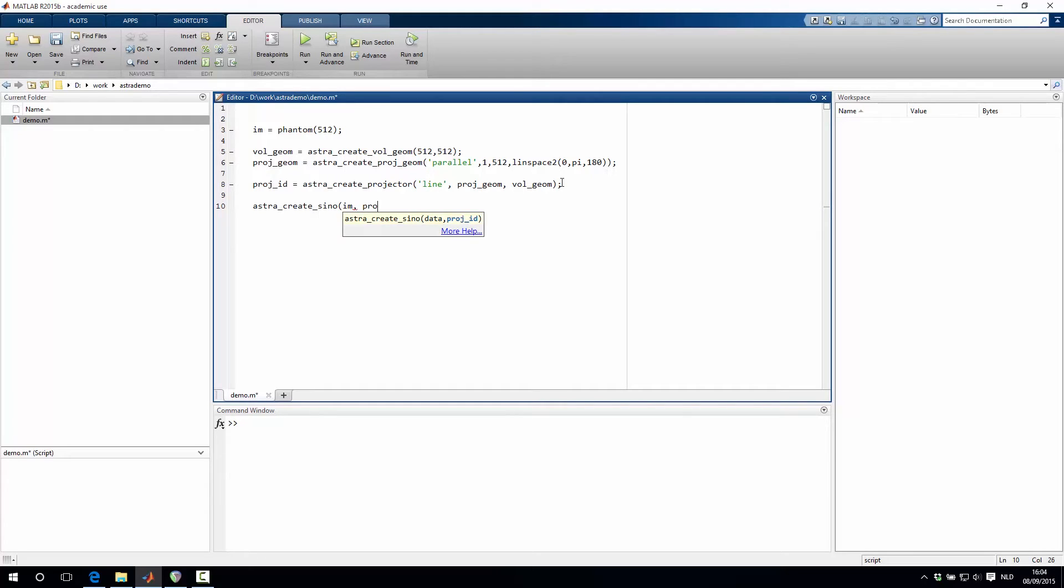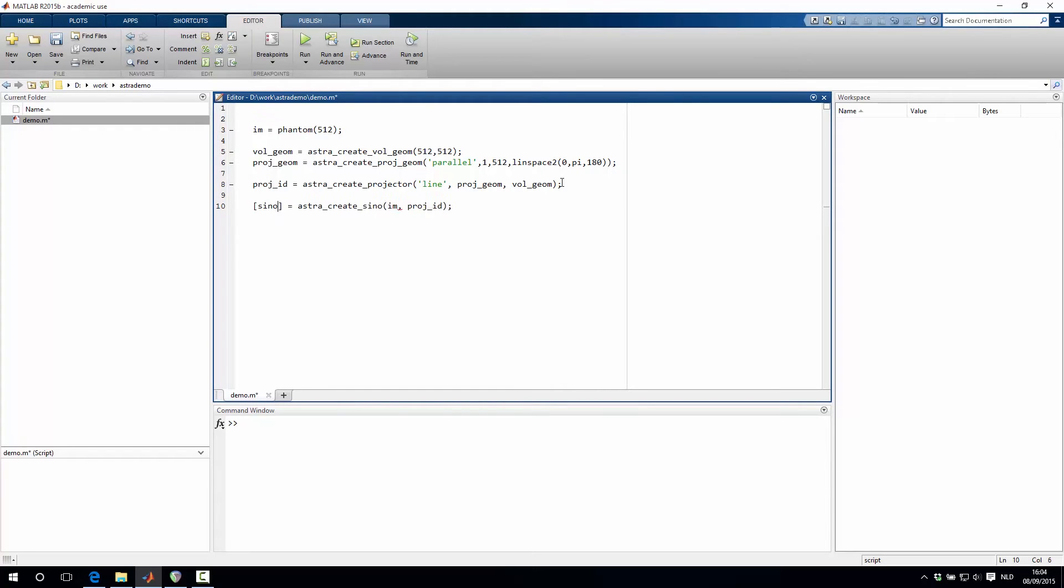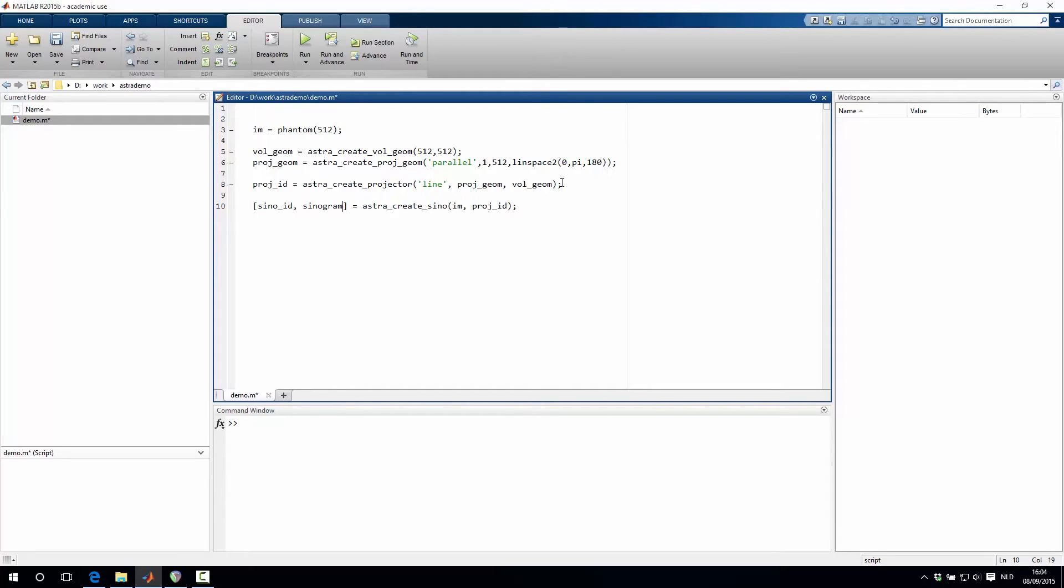And we want to add also the identifier to the projector. And then what this returns is an identifier to the object that holds the sinogram, and then if you want, you can also return the sinogram as well.